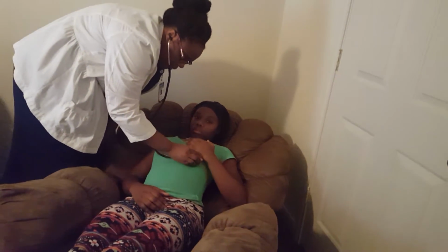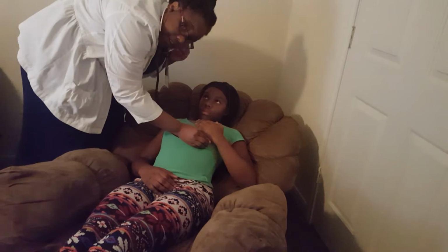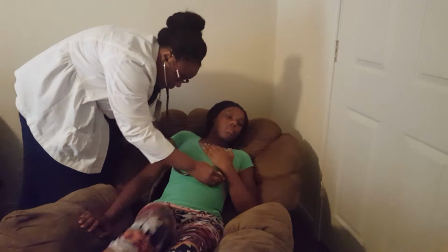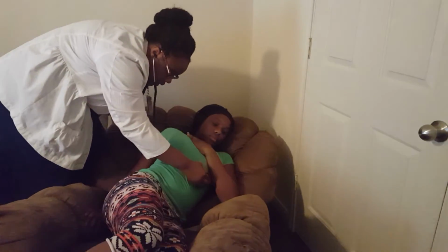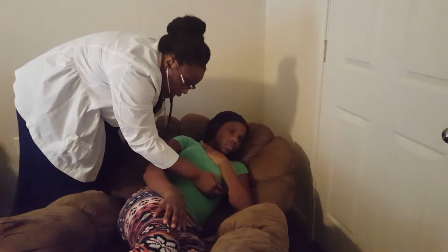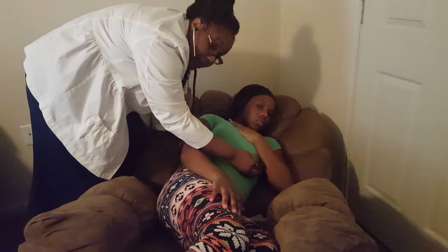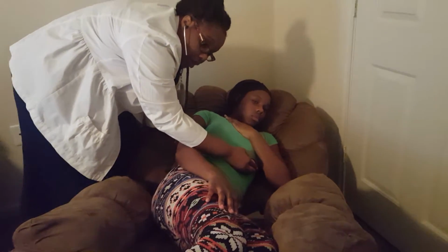You lift your breast tissue up again. And if there were S3 or S4 sounds, they're heard loudest at this apex. And you can also ask your patient to turn to the left side. Can you turn to the left side? Okay. This would make it a little easier if the sounds were there to hear it, because it brings the heart a little closer to the chest wall.